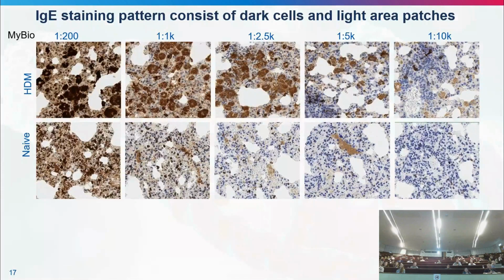And to represent it here, if you have a very concentrated antibody, any of them would have the same pattern. You would have cell nuclei labeled. You would have huge, massive areas around some of the cells, very positive, and you also have background activities. So remember, IgE is a secreted protein. Is this the right pattern? Or do I need to go that low? So I cannot quite cut the line and understand what is the actual pattern for these antibodies.